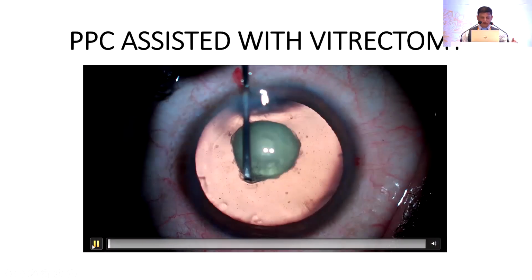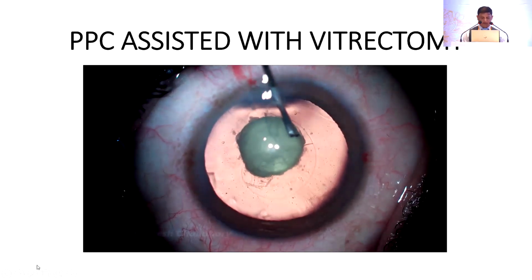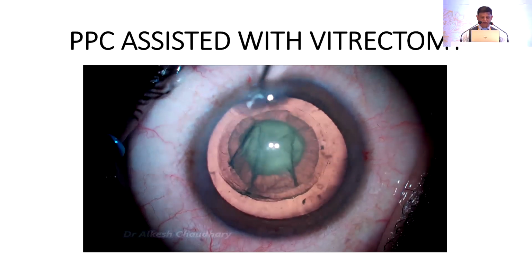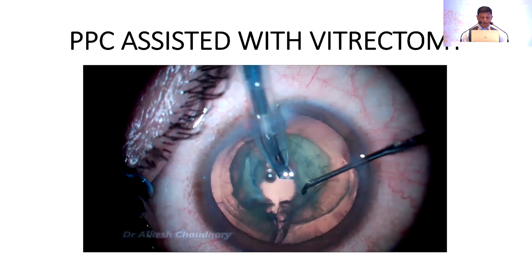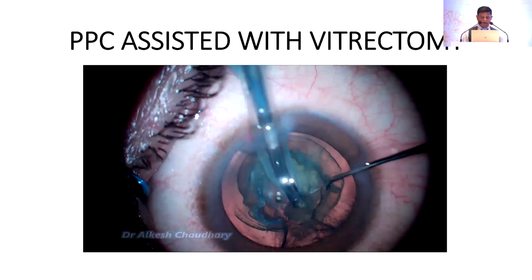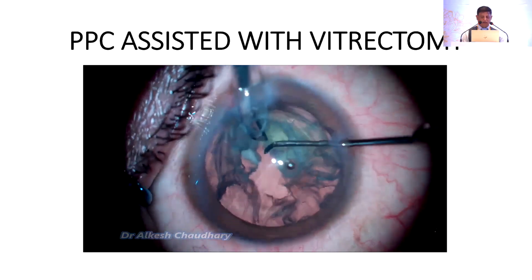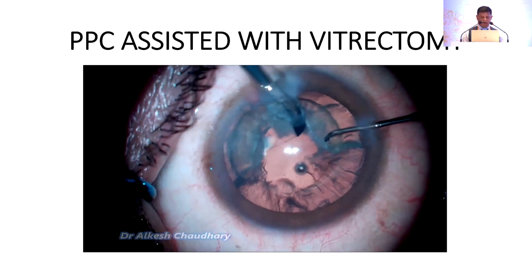So doing a good capsular access, around 5 millimeters, and only hydrodelineation, no hydrodissection. Completing the phaco with just a small break, it was not a very hard cataract. You see with the chopper itself, we are bringing the nucleus in front and then removing it without causing any rotation. Again, you see bringing the nucleus.